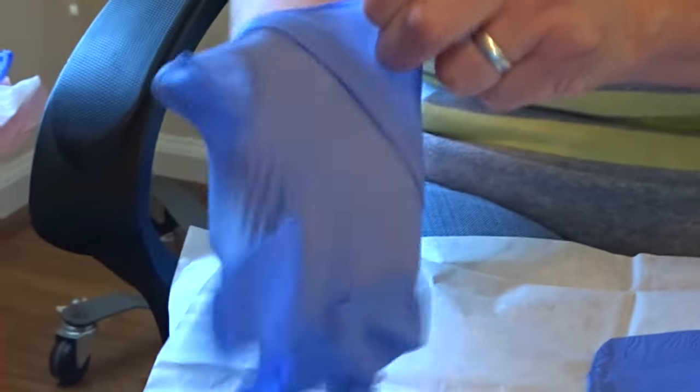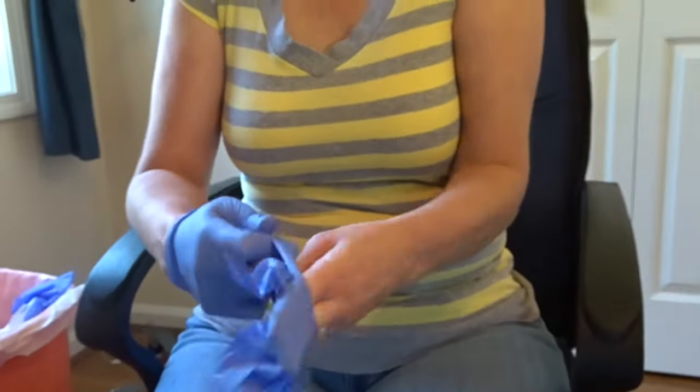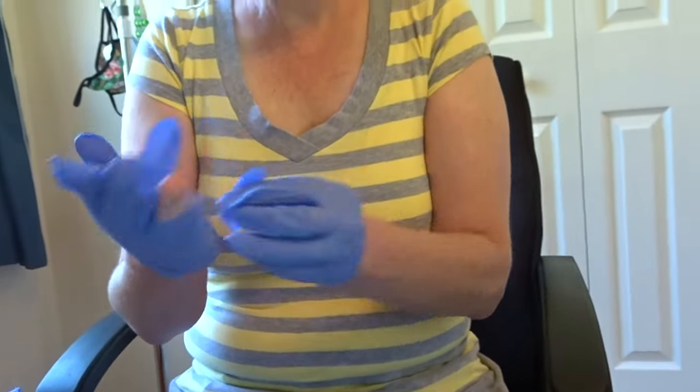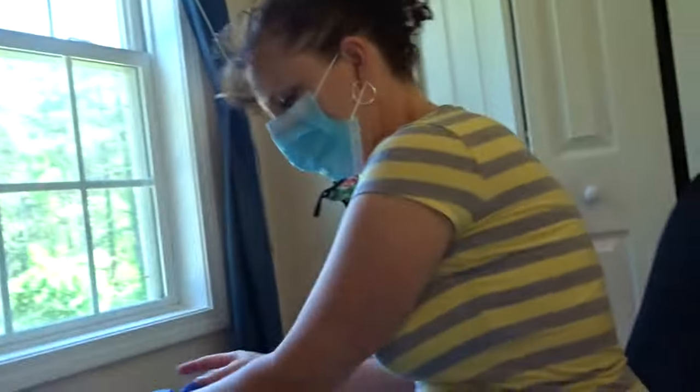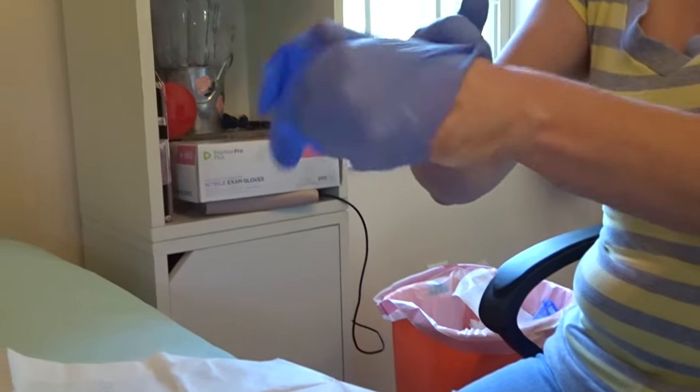If you have one glove already on, the second can be put on without being as meticulous because one hand is already sterile. The gloves can get complicated to put on — sometimes they break and then you must start over. Wiping your hands with alcohol enables the gloves to slide on easier if you are having a hard time.